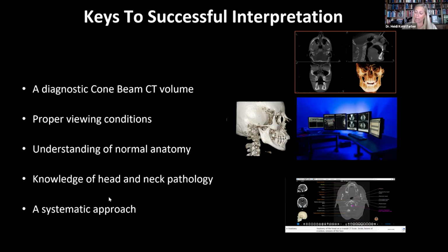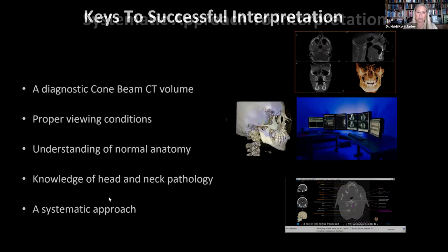Understanding of normal anatomy. And again, that's why I would say go and take a course, or sit down with a good anatomy book and review your anatomy, but definitely take a course. A knowledge of head and neck pathology. So again, at a course, they would review that head and neck pathology with you. And then, of course, you want to have a systematic approach to evaluating that patient.